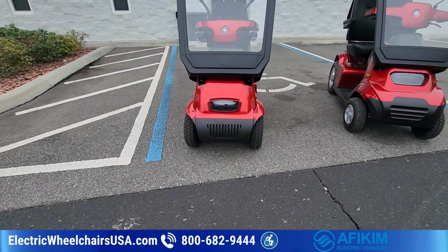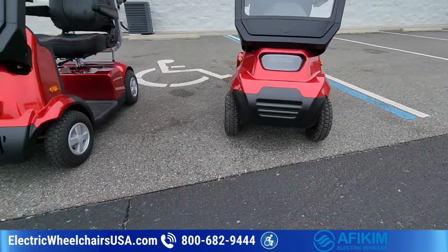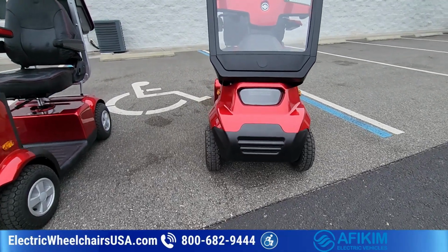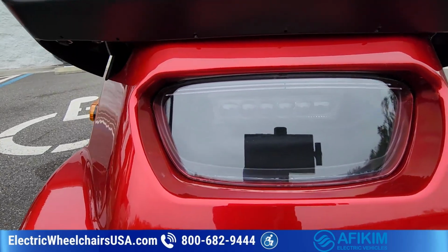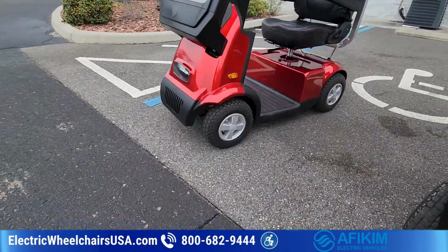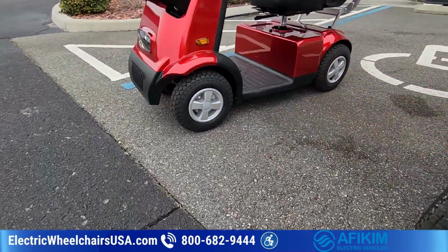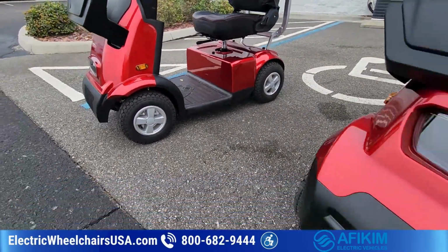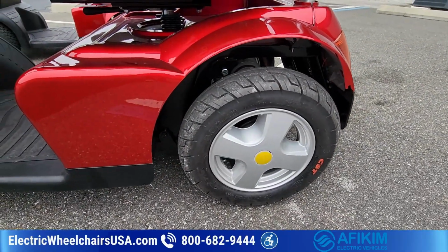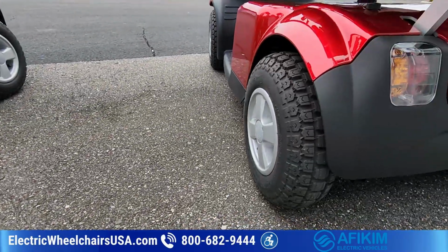What are some of the differences? So you can see clearly the light on the front of the C4 is not quite as big. The front's very similar, but the S4 is actually the same light. It's just the windshield of it is a little bit bigger, but it's the same light. Also, they have the same front tire. I believe this is an 8-inch tire. Same exact front tire, but that front tire on the C model is the same one that is on the rear. Now the S model, because it's a higher weight capacity, has this larger tire, which I think is 14 inches. So here's the tire on the S4 on the rear, and that's the C4.